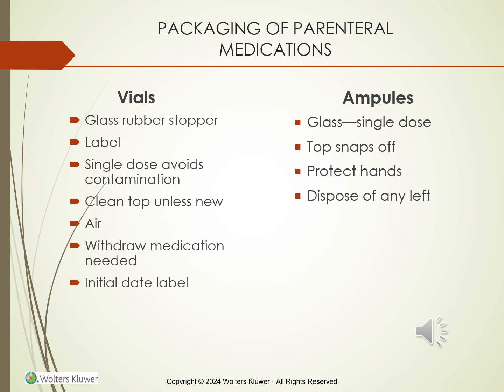For larger volumes of fluids, contrast media, or medications ranging from 50 to 1,000 mLs, heavy plastic bags are used. These bags collapse as the fluid is infused, and they have two ports, one for connecting IV tubing and another for adding additional drugs for infusion.